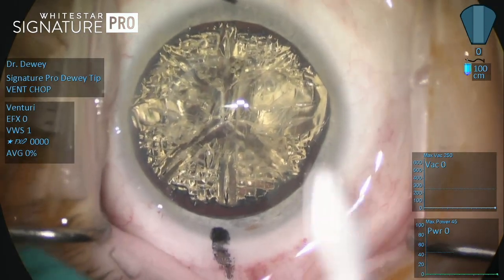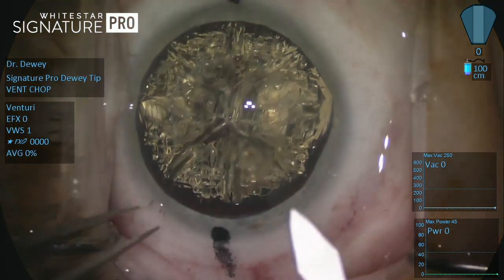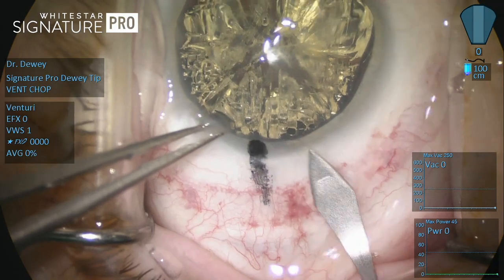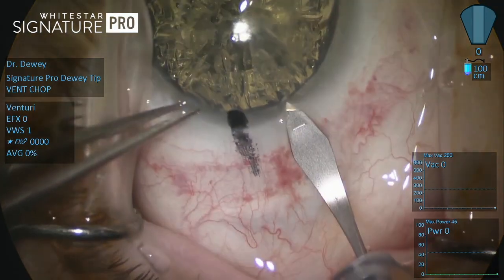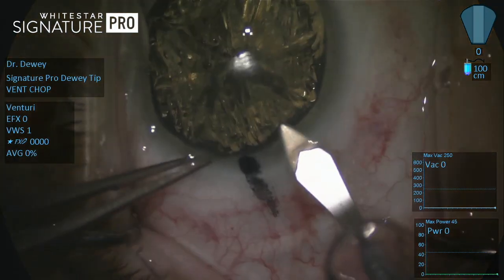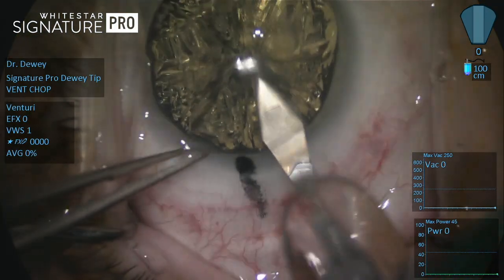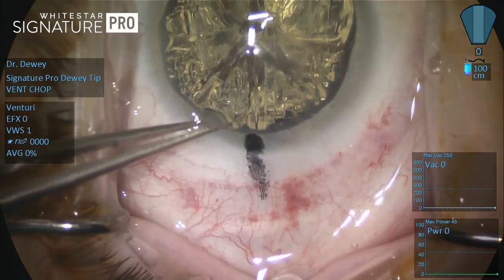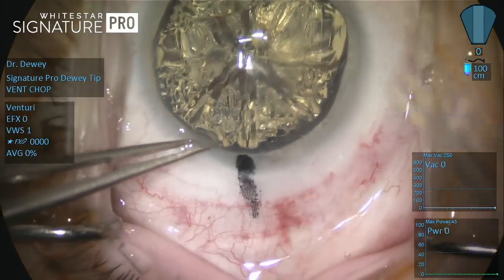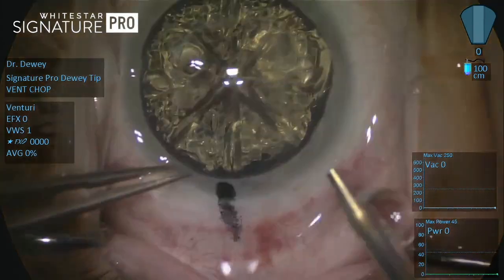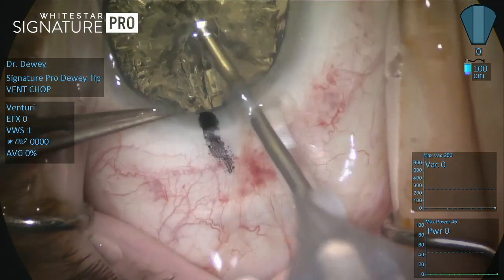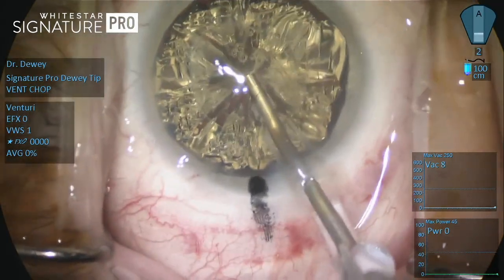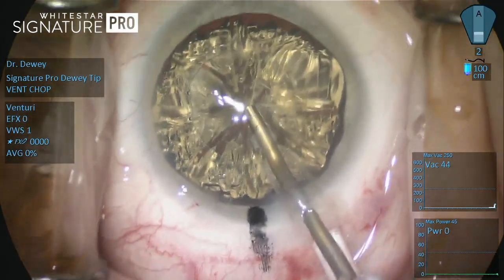Vacuum systems differ in how the vacuum is created. At occlusion, once all flow ceases, the vacuum types are the same. The action of fluid in the anterior chamber is dictated by flow. Vacuum only takes effect once the fluid and fragments reach the threshold of the needle. Flow is the effect that brings free material to the tip of the needle.